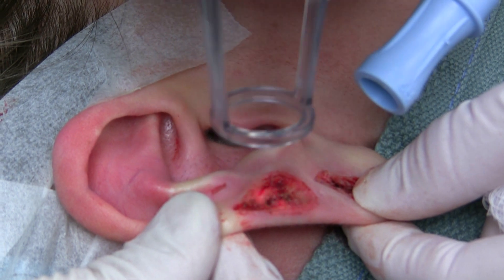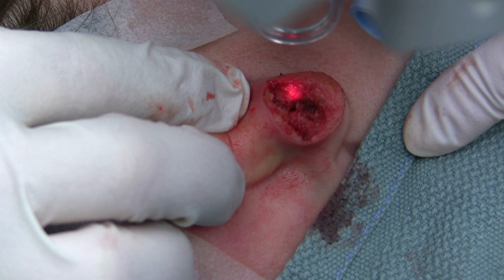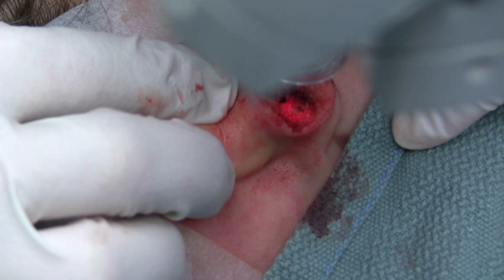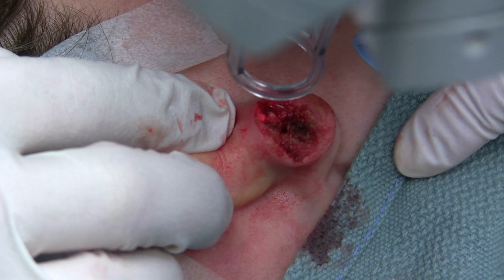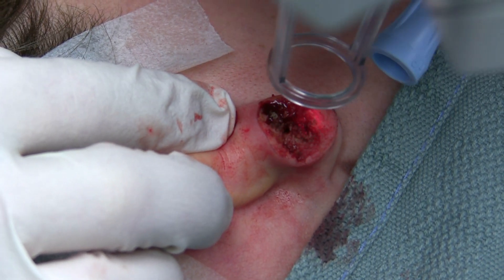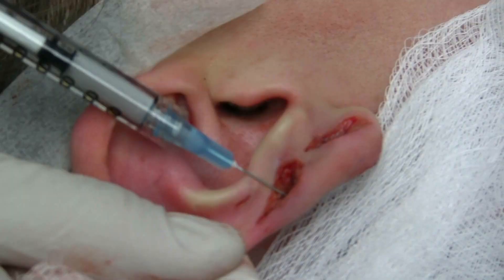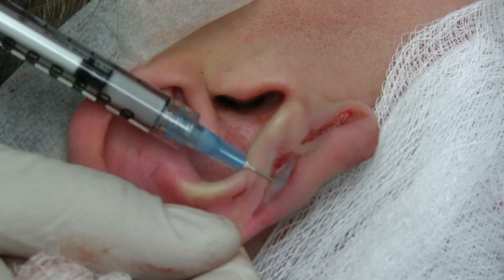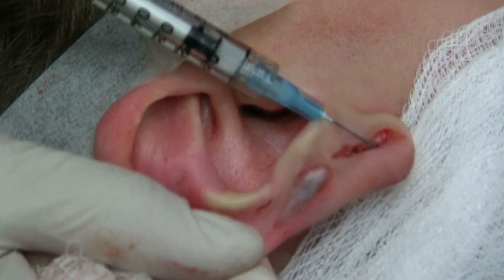This is what we're hoping will improve the chances of this keloid not recurring — by the Deep Fractional laser. And we're putting a little bit of Kenalog in here intralesionally, and we'll do this on a monthly basis.